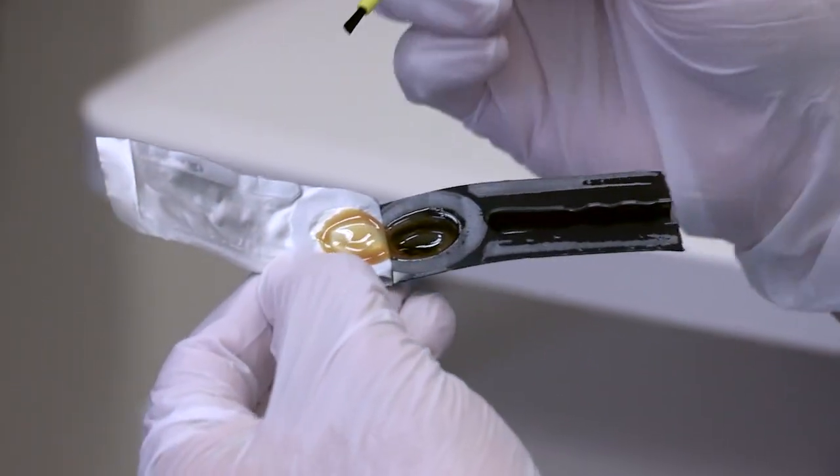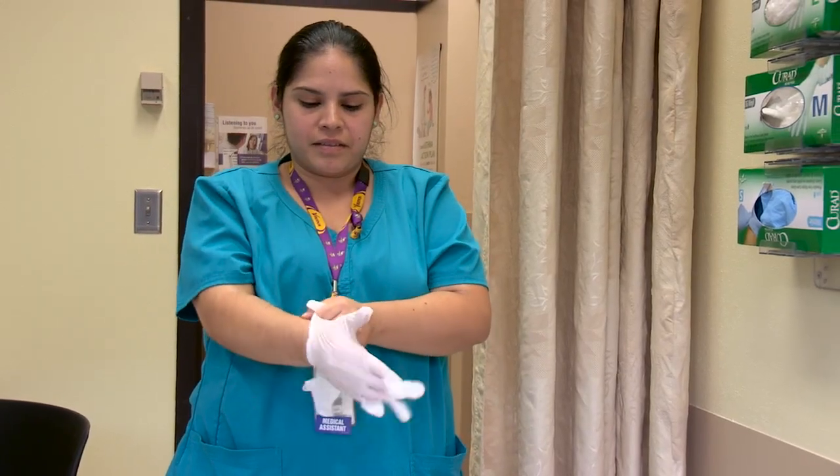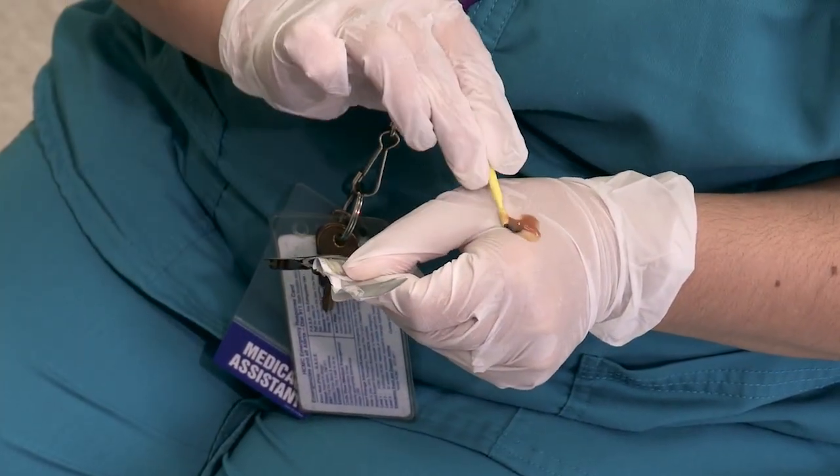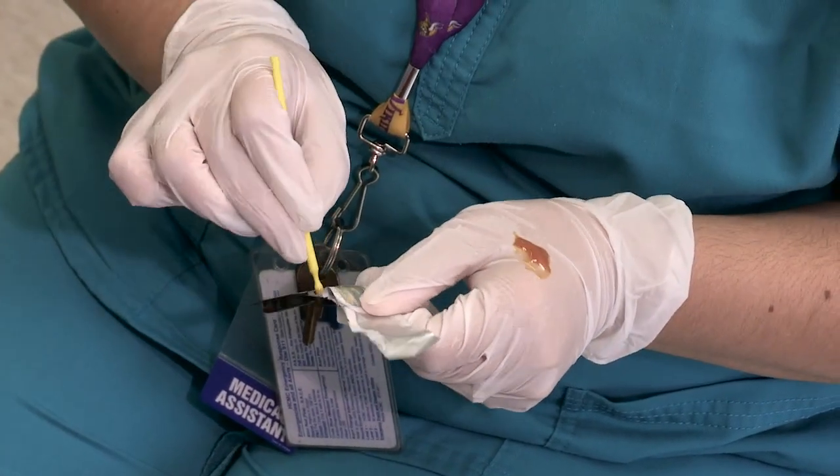After washing hands, put your clean gloves on, which do not need to be sterile. You can put a small amount of the varnish on top of your non-dominant gloved hand.